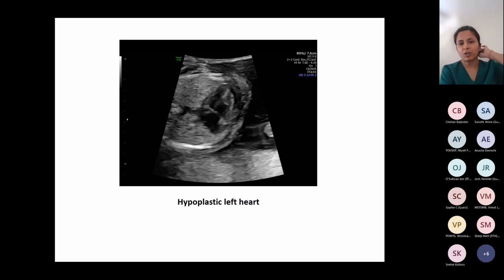Okay, this is a picture where I suspect you can see there is a problem going on here. Don't worry if you cannot, but I'll just point out to you, there's the heart, not looking quite like how we are used to thinking a heart looks, but of course, a little bit like that. There's the apex of the heart. This is the base of the heart. There are the two atria. These are the two ventricles.